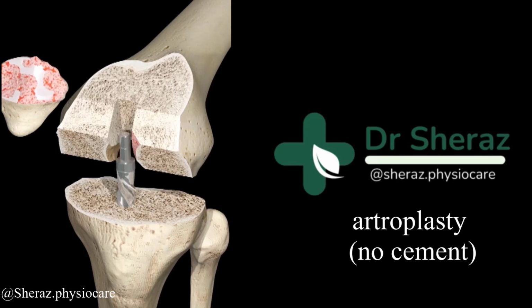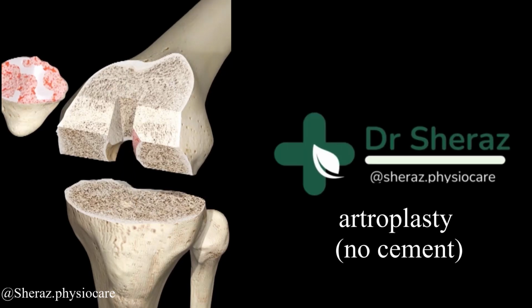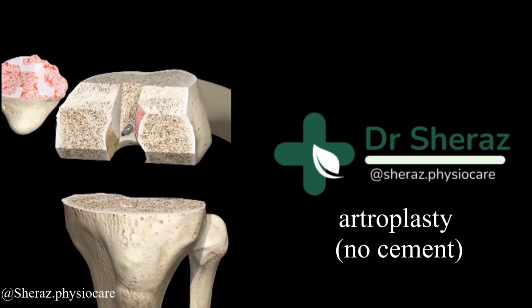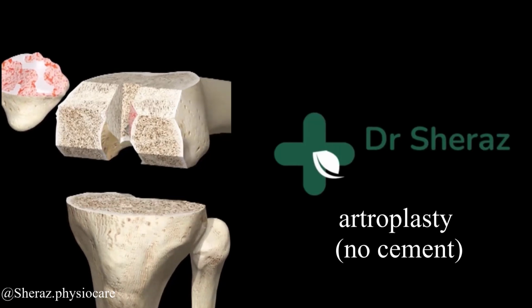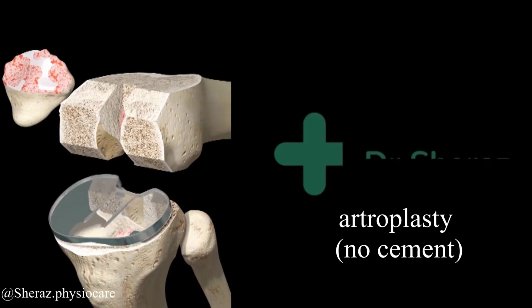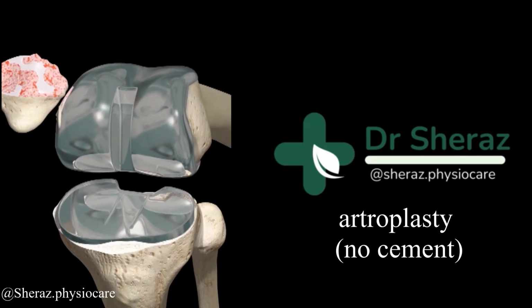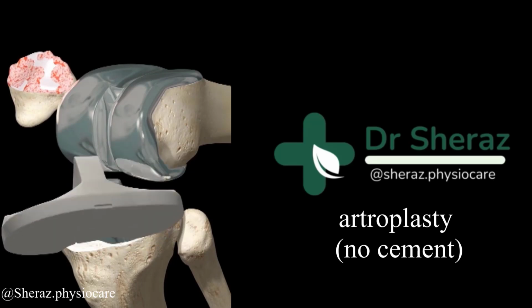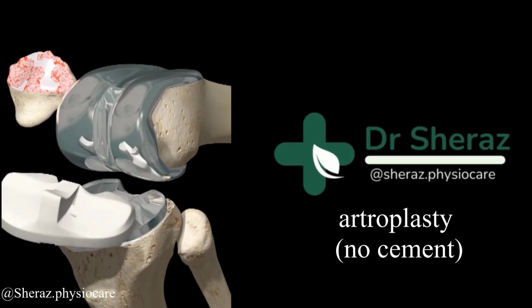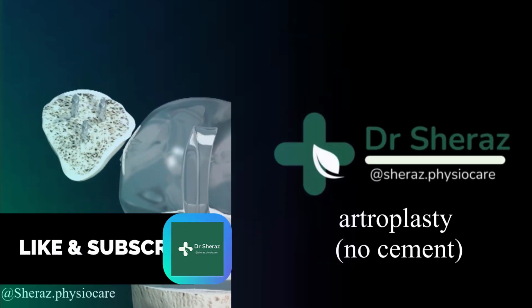Holes are drilled into the bones to allow placement of metal components. Metal articulate plates composed of porous metal are then impacted onto the bones without using cement. A polyethylene surface is applied to the tibial plate to assist non-abrasive articulation with the metal femoral plate. Contact of this porous metal with the bone stimulates osteointegration, forming a strong direct bone-implant interface.